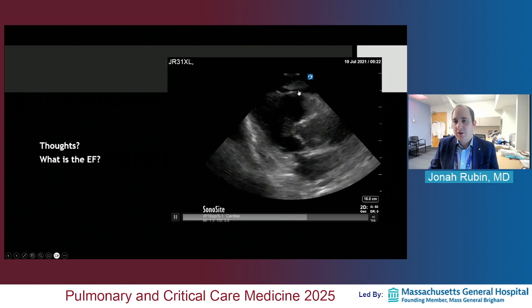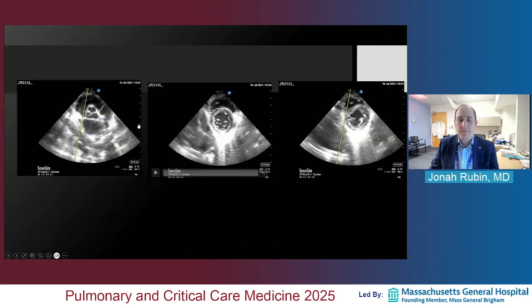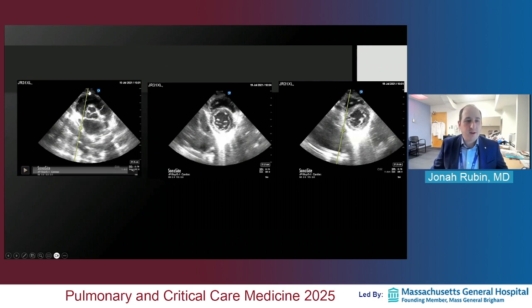You might notice a little pericardial effusion up top over here. You might notice maybe that the aortic valve is a little thick, but it's a very limited view. But this is just the reality of what you might get in the MICU. Ignore these yellow lines, and forgive that my depth is so deep. These would have been really beautiful clips if I didn't do those two things.